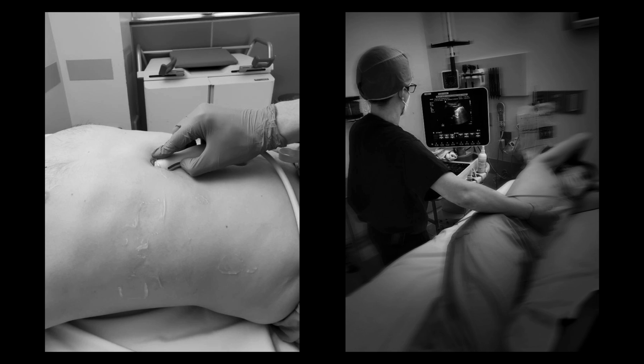So from a patient positioning standpoint, if the situation allows, and I know that some of our listeners work in the ICUs and have patients who are on the ventilator and multiple drips and central lines and they're in restraints and all sorts of things that preclude the patient from really moving too much, right? To reposition the patient can be quite the ordeal.